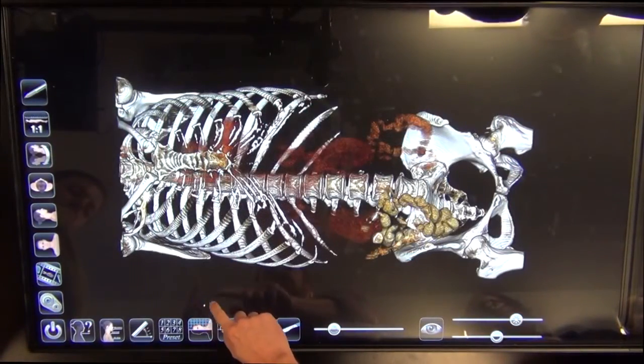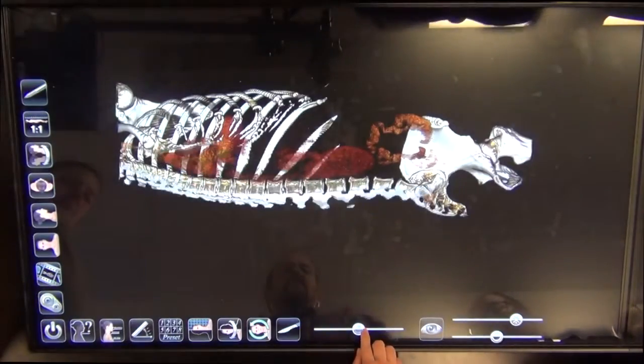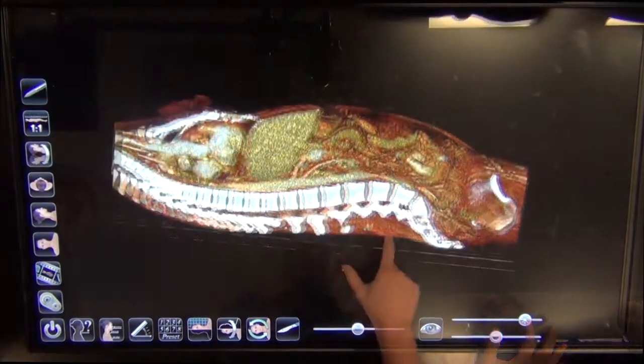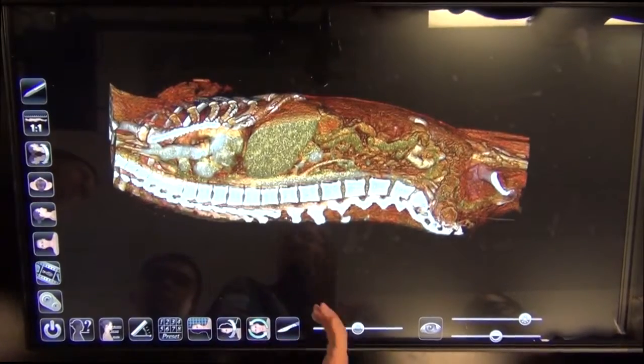Overheard a teeny bit of what Dr. Gosling was talking about, but we can cut into this. We can do a sagittal view and just go over some of the levels of the vasculature. Okay, so if we're looking at this, what level do you remember the aorta goes through the diaphragm typically?